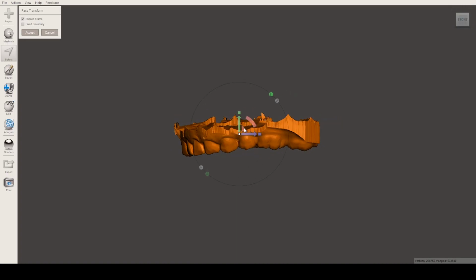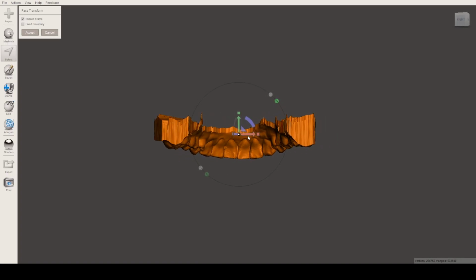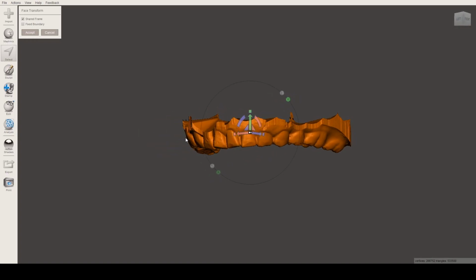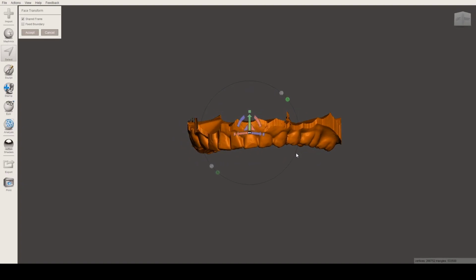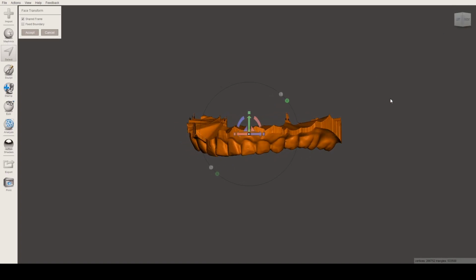This is the left, which should be the front. Let's click that actually. Oh, I just clicked the blue button, which expands it. So this expands it to the left, the red, if you face it like that. This one expands it to the left, and this blue button here expands it to the right. Let's just move it back to the original, and have the normal size model. So here now we're facing it. We want to rotate it to the front. This is the front right now, and we want to rotate it a little so that it will become the front.